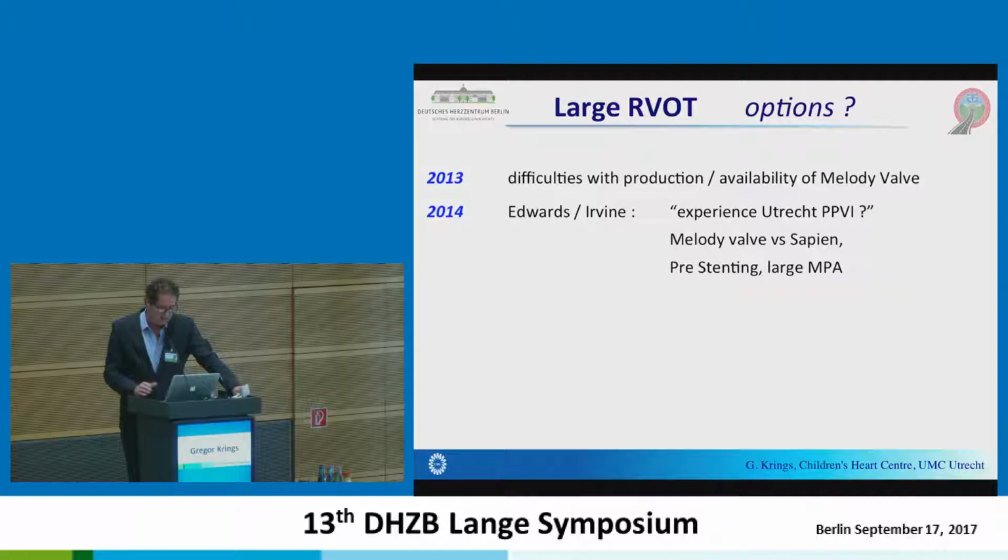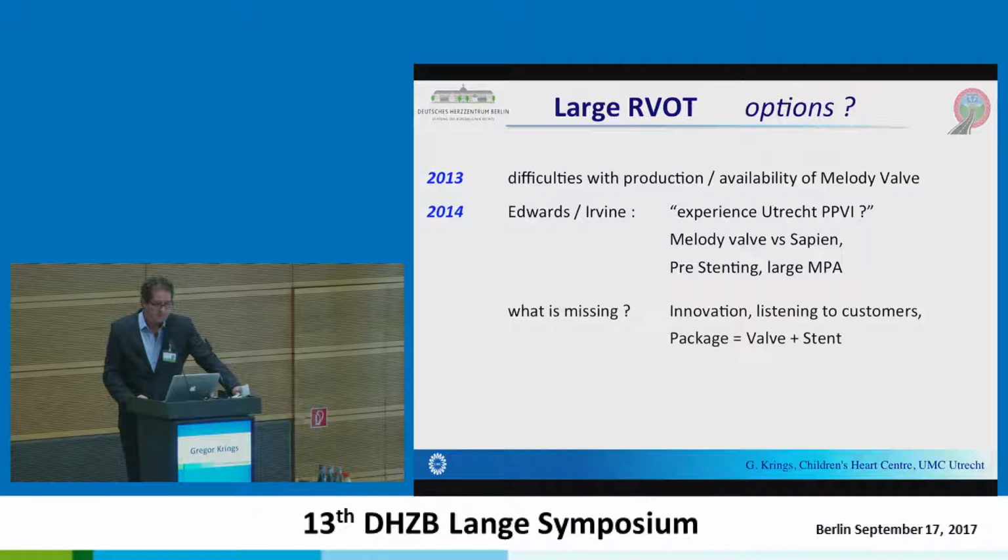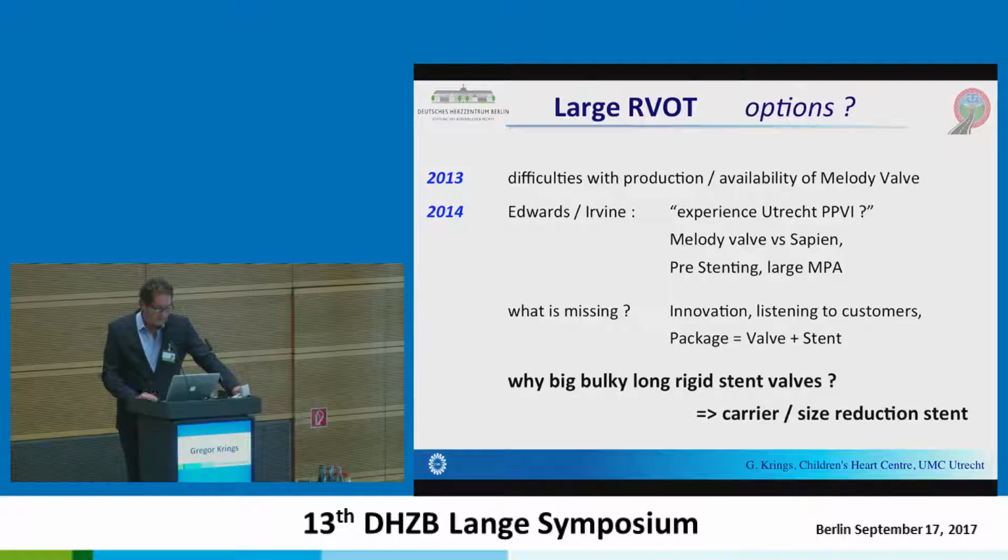There were people listening to ideas, and actually they were asking, what is missing? What do you guys in the clinic need? What are things to talk about? What are projects which probably could be promising for the future? Well, we discussed things like make a package where you have a valve and the stent, probably combine things.